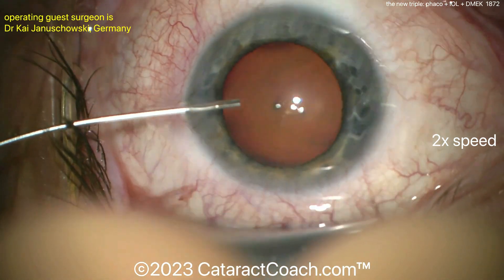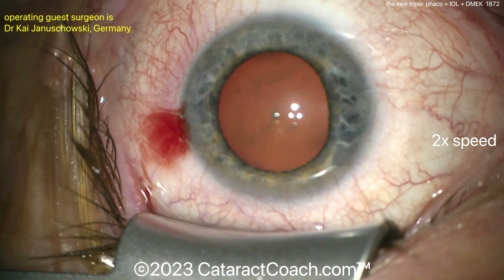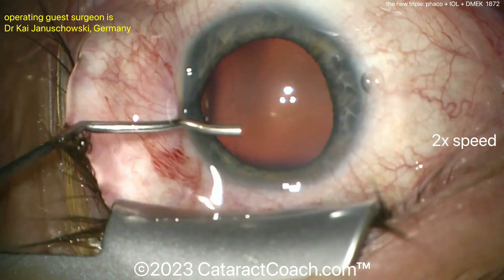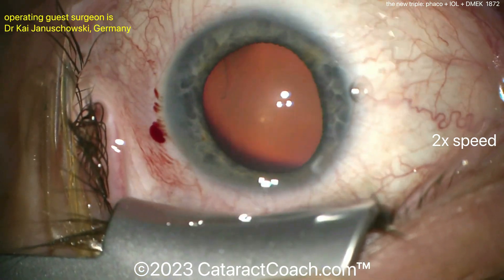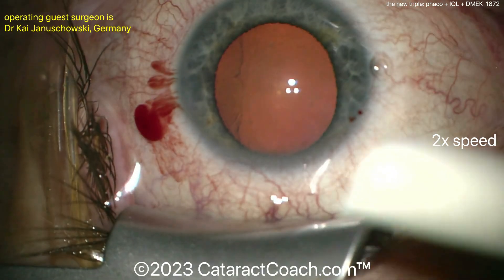Here's the case where the patient needs to have cataract surgery but also have a DMEK at the same time. Triple refers to the three procedures: FACO plus IOL insertion plus corneal transplantation. But in this case, the new modern triple, instead of doing a full thickness corneal transplant, you're just doing a lamellar one.